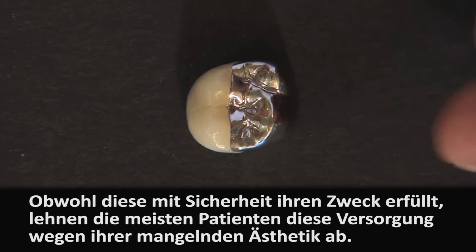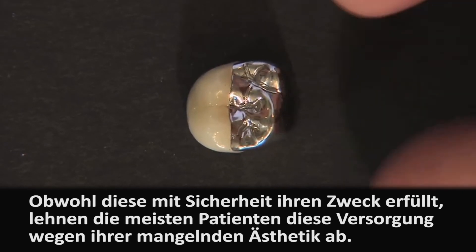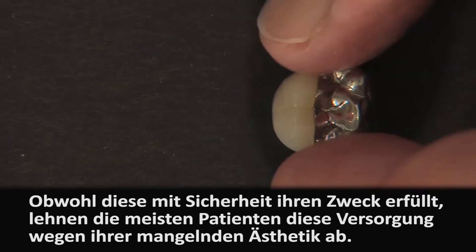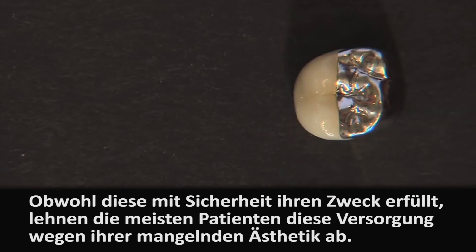Patients aren't real thrilled when they see a metal occlusal PFM. I remember early in my career having a woman question the $750 she'd spent on a porcelain crown and why it was half metal on half the top and half the inside — she could see it with a mirror on the lingual. So that's a solution, but it's not necessarily one where the patient is going to say, 'Oh, great idea, doc. I'm glad it looks like that.'